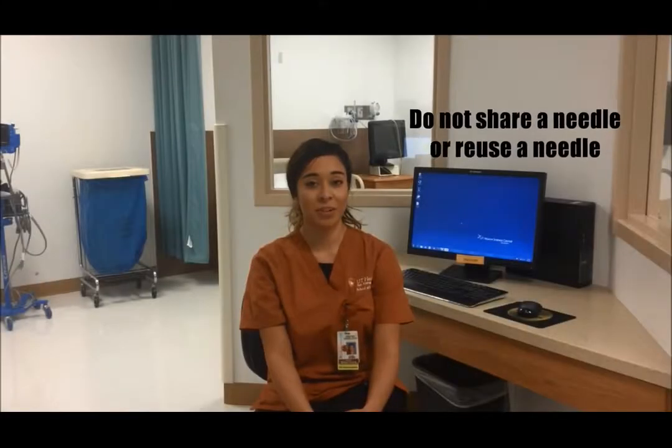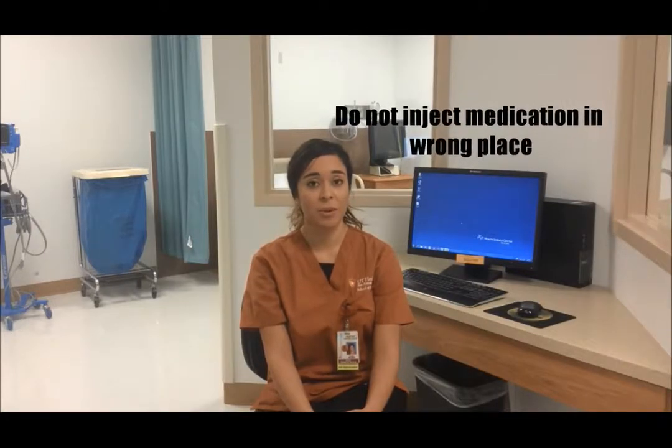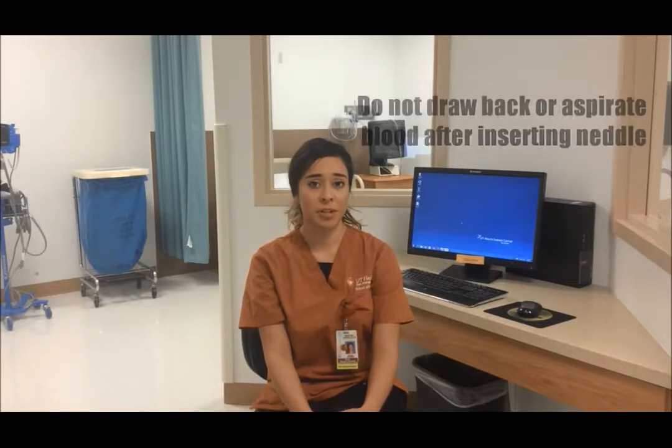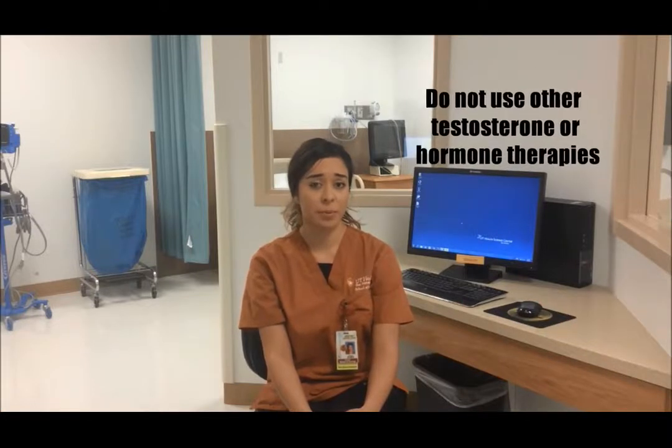Do not share a needle or reuse a needle. Do not stick the medication into your stomach or posterior arm. Do not draw back or aspirate blood after inserting the needle. Do not use any other testosterone therapies unless prescribed by your provider.